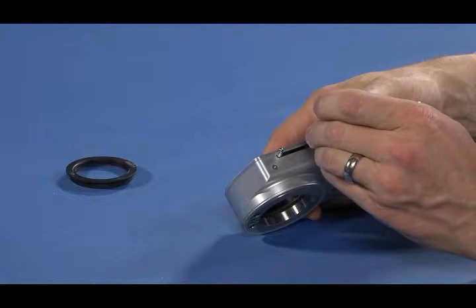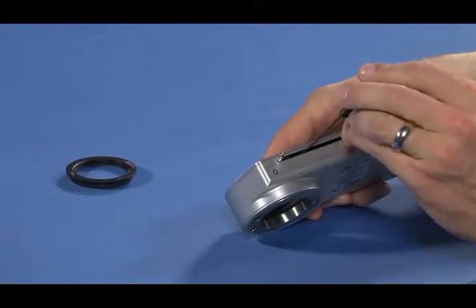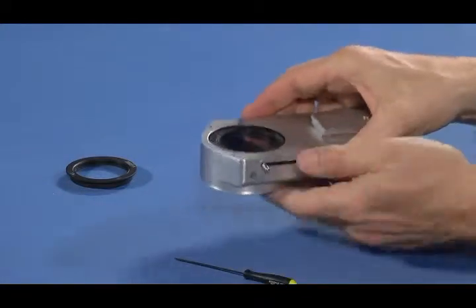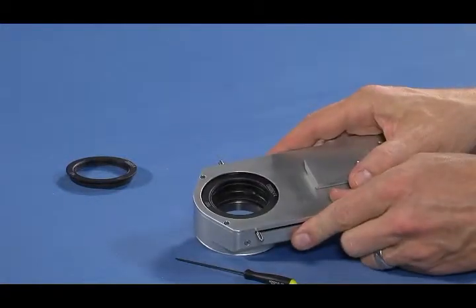Secure the lens in place by tightening the set screw. Check that the lens is secure by covering the top opening and turning the CLA upside down. You have now replaced the condensing lens in your CLA.